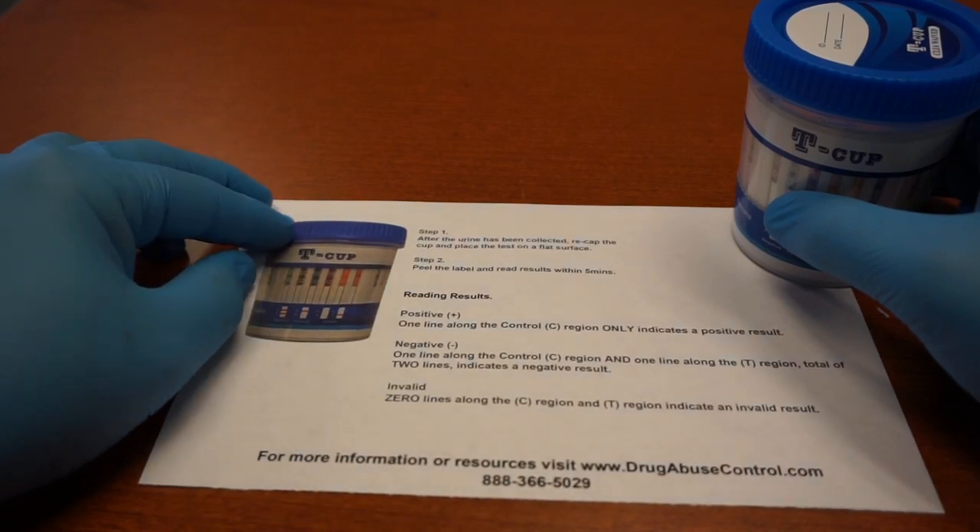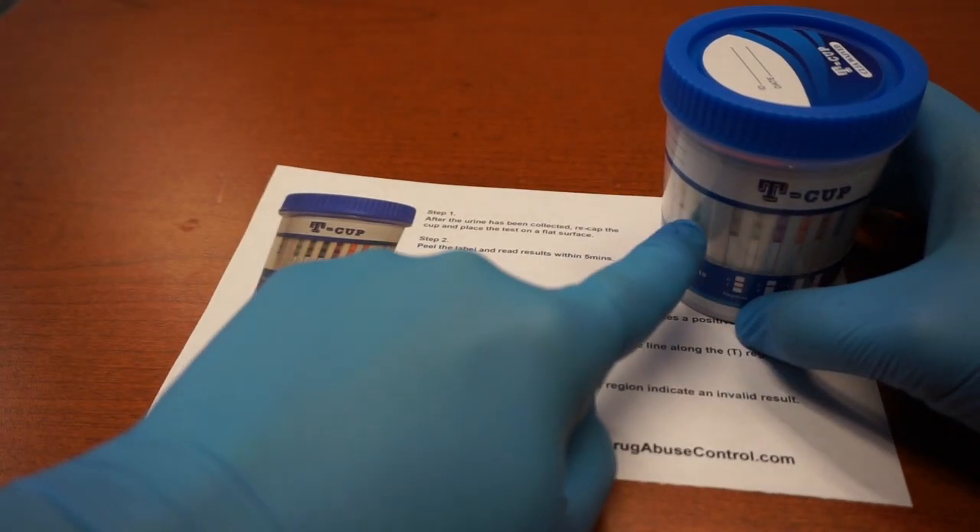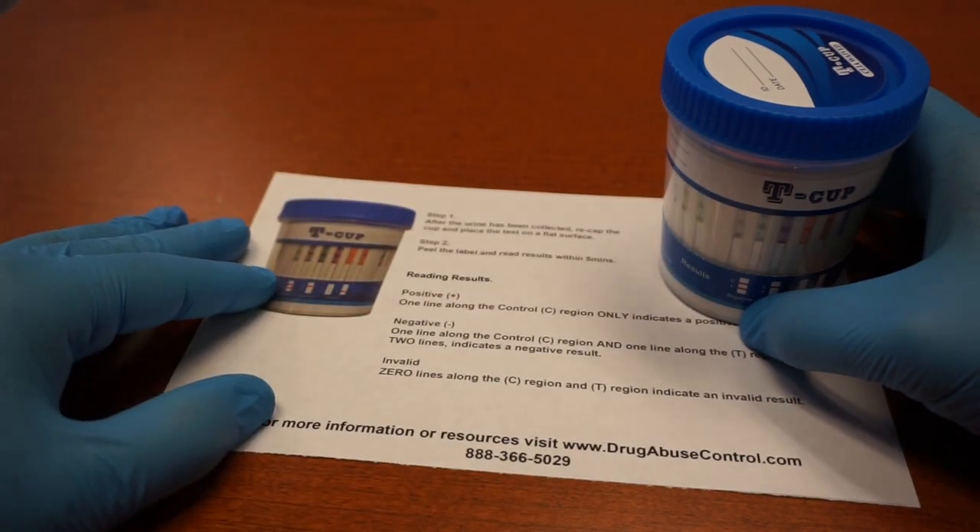Basically, it's very simple. After the urine has been collected, recap the cup and place it on a flat surface. Peel the label that's across the front here and read the results within five minutes.